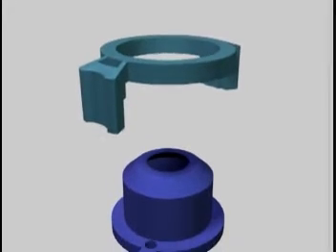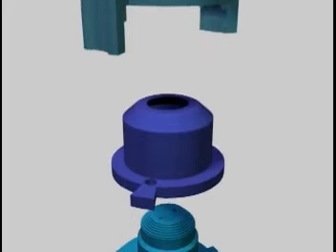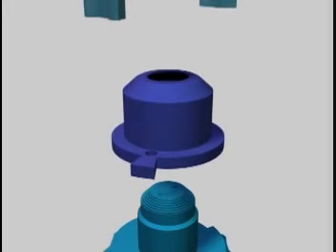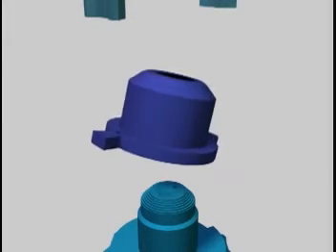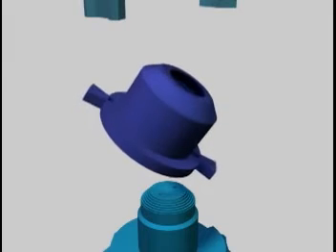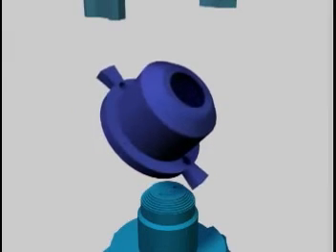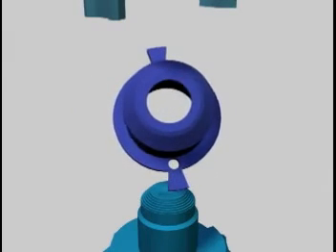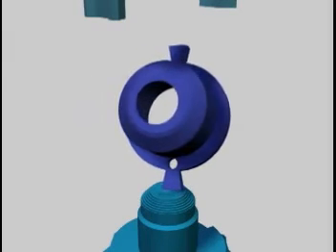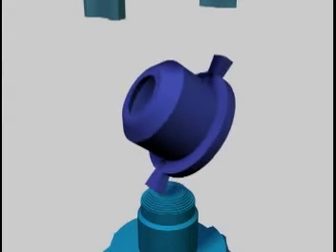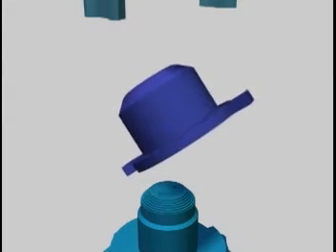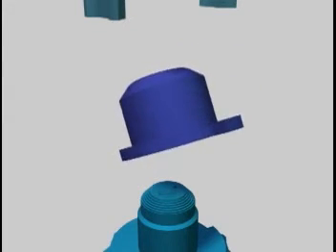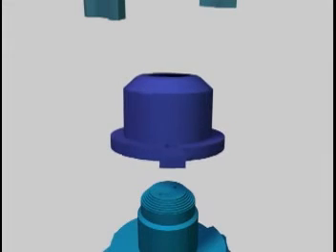The Corneal Tissue Retainer: This device component has ridges on the inferior surface of its top edge that are designed to match complementary ridges on the top of the base component. Once secured, these ridges provide a degree of traction that prevents movement during tissue manipulation.